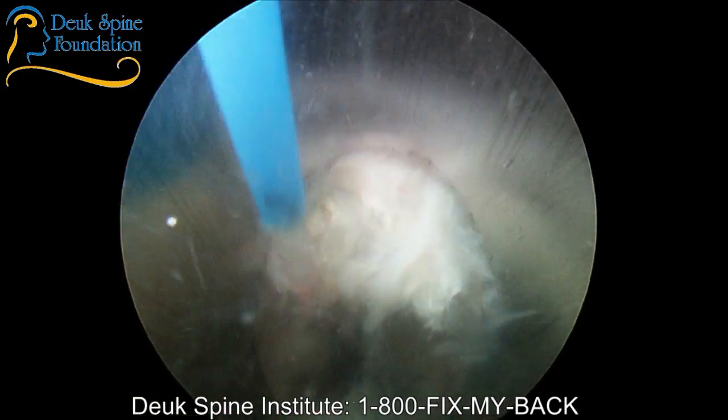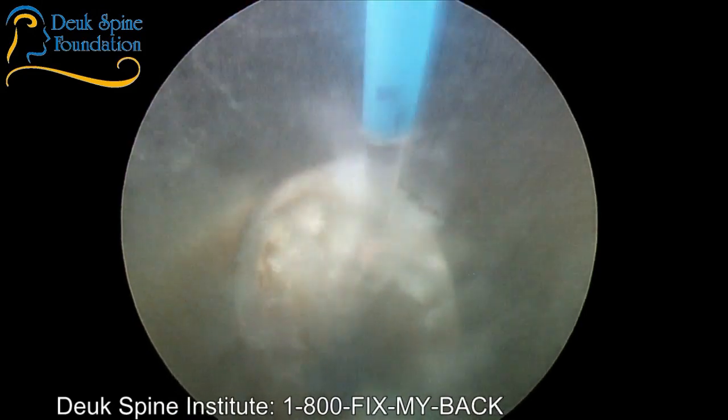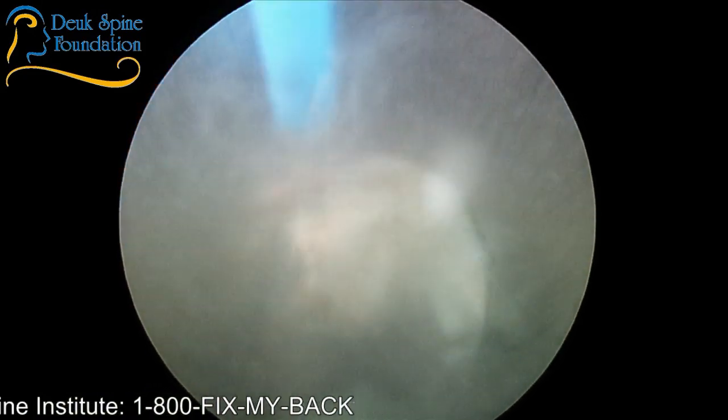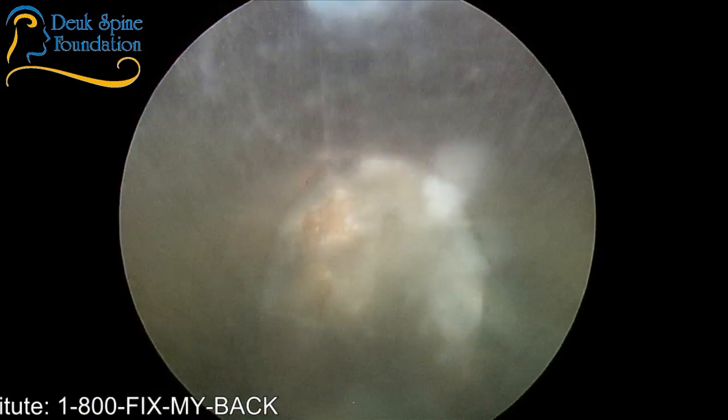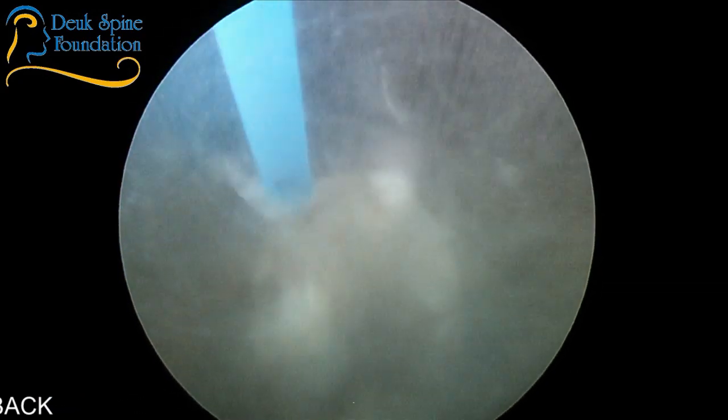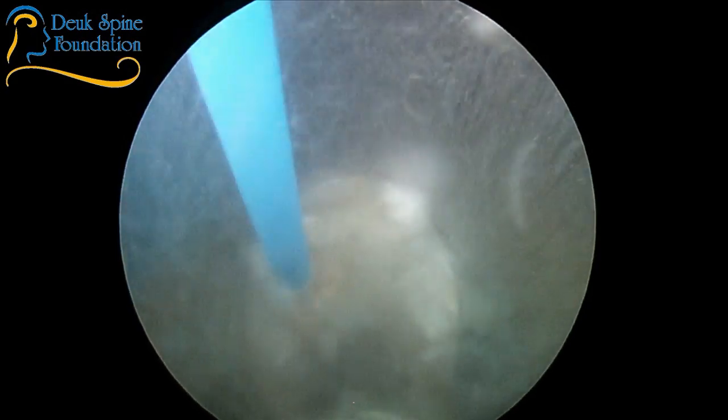Many times there's granulation tissue, by the way. That's the pink color. I was telling this patient about this before surgery. I said, the disc is definitely a source of pain, and the pain comes from the annulus fibrosus. It comes from the walls of the tear, on the side where there's granulation tissue growing in from chronic inflammation.